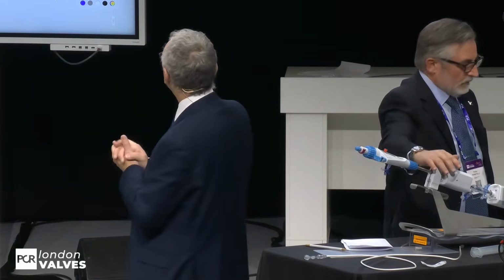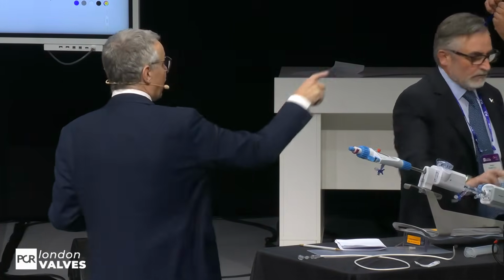What is behind this decision is actually the chordal distribution, or let's say leaflet distribution. But what is really important is what is below the leaflets, and echo will not show you. CT scan will not show you. So you will have to do it blindly, but at least in the simulator, we are able to describe what it is.